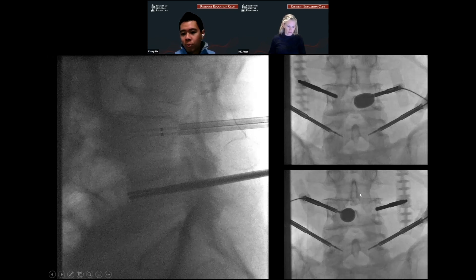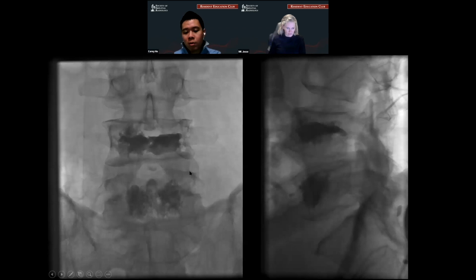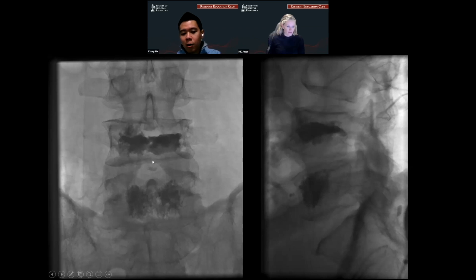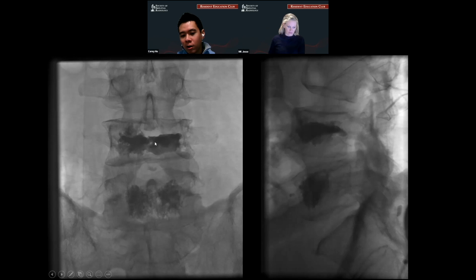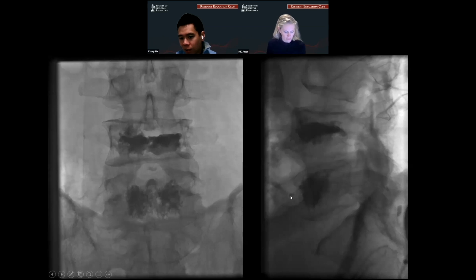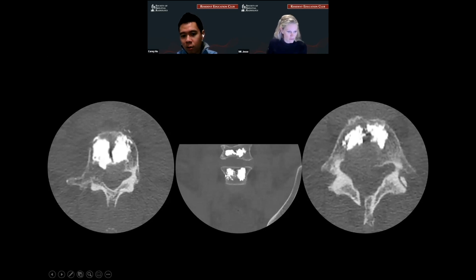I brought two balloons up for both levels and then placed probes to ablate the bottom level. You can see that we're getting pretty good end plate to end plate coverage — definitely want that midline coverage, and we're getting it at both levels. Notice the difference in the fill between the L4 and L5 vertebral bodies. In L5 you get what I'd call the fuzzy nugget appearance, meaning there's a little bit of trabecular normal bone left. In L4 it's very lobular, meaning there's a lot of tumor in there. This patient had a CT later for abdominal pain, and we were able to see our work — very good fill medially and end plate to end plate.